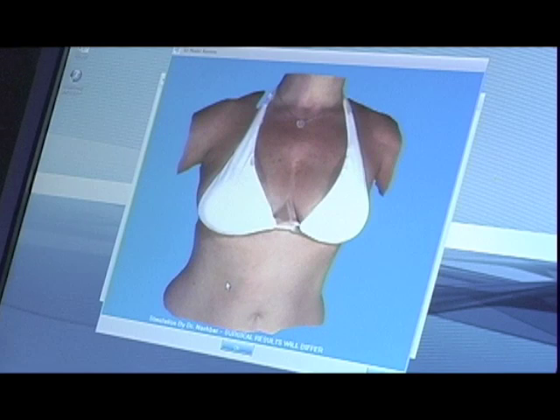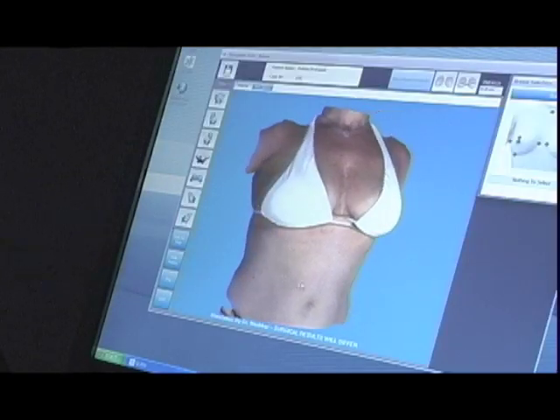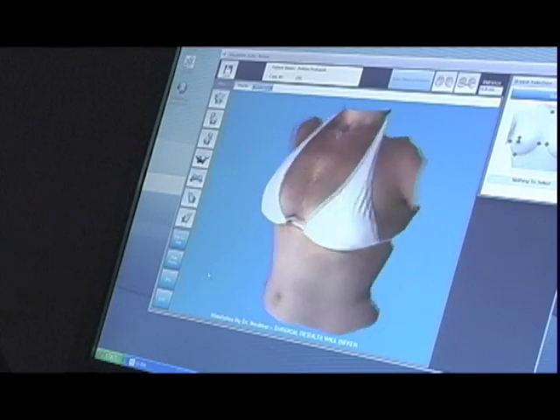Of course it takes a minute or two to actually do the calculations to produce that. Once the computer has finished creating the model, you can see how the breast looks from different directions. The photographs are being taken either with a bra or without a bra. A bra is very helpful if the breasts are a little bit droopy.